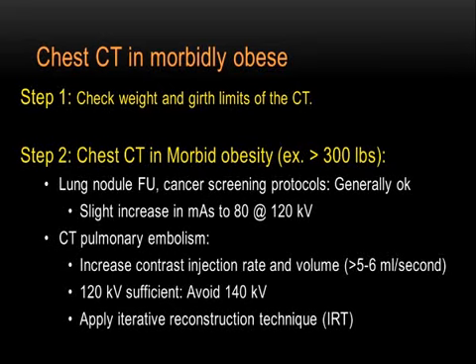How about the chest CT? Before we jump to the chest CT, there was a paper published not so long back, in which they reported that if you happen to have an old scanner with a limit of 350 to 400 pounds on the table, they made the patient stand at the back of the gantry, bend his head down, rest it on the headrest on the table, and scanned the patient without making him lie on the table.